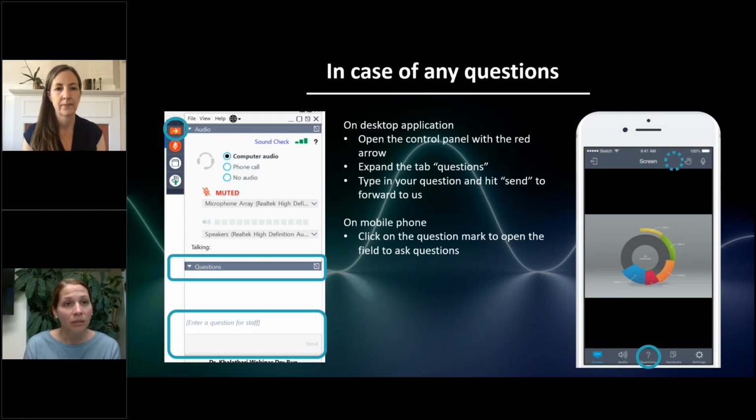Thank you. Next question is, how would you value measurement of pattern VEP compared to photopic negative response? So VEP, as opposed to the photopic negative response or the pattern ERG, which are being measured from the surface of the eye, either using a DTL electrode, which is what we used for our desktop work, or using the surface electrode for the portable work. And so that's measuring the electroretinography.